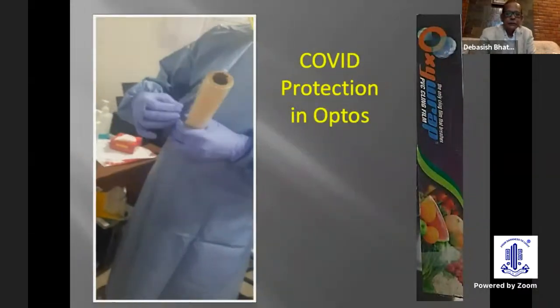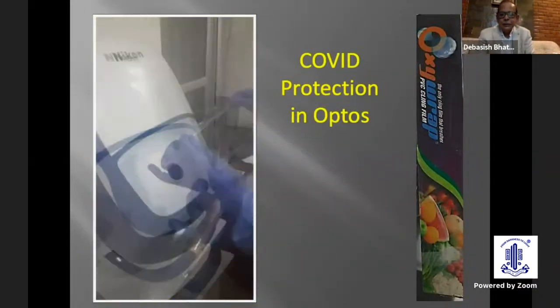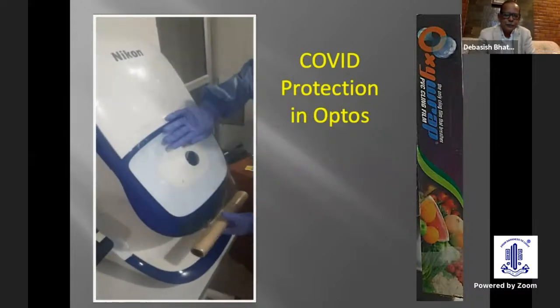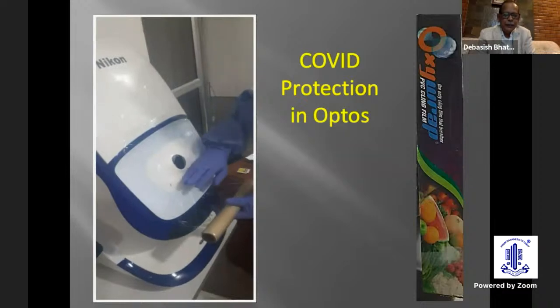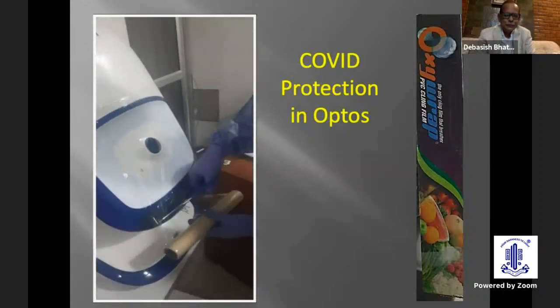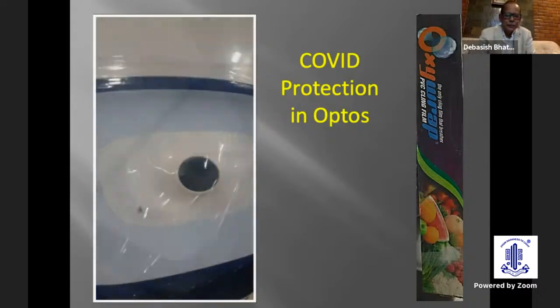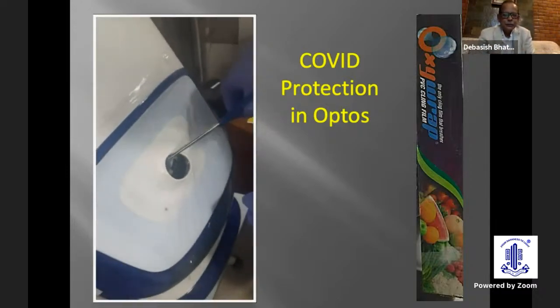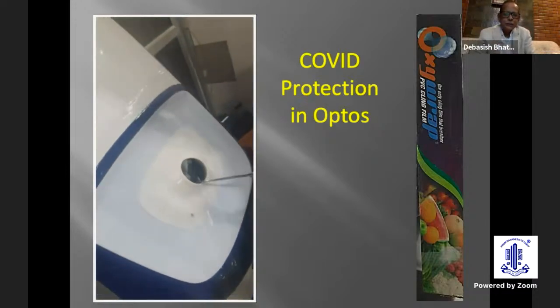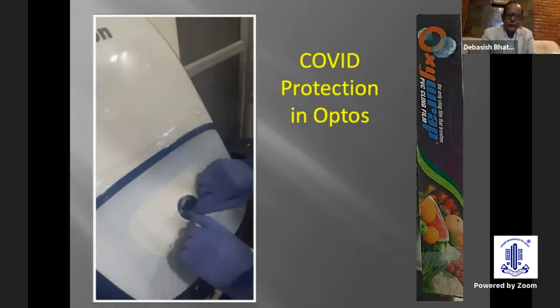Another useful thing is, during COVID time, we use cling films, which are very inexpensive, for every case. It takes about 1 minute to do this. And the patients are safe from whatever contaminations that you may say. So you just stick it on and make a central opening, so that you can do the imaging properly. And this is quite patient friendly. So this is one thing we wanted to share with you.